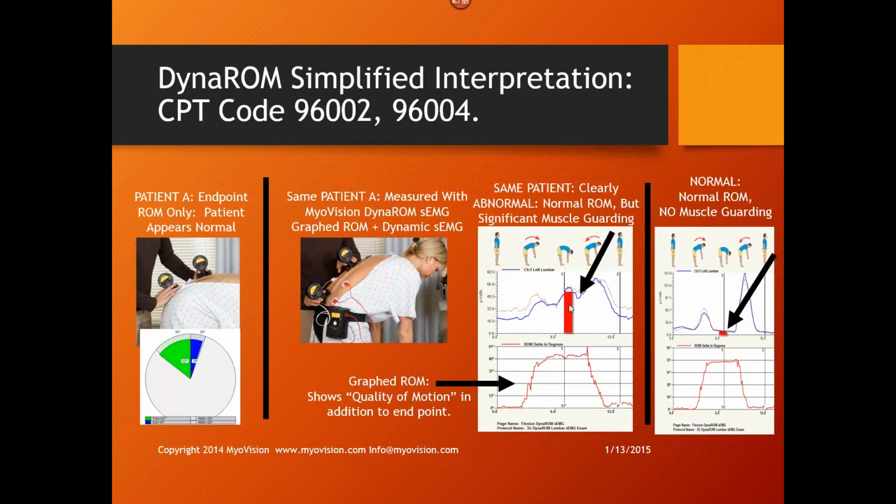Now, just to point this out, for those that are doing personal injury work too, we have a whole new thing I want you to know about where we actually show in these graphics. Attorneys are going crazy over this. You can bill it. We're getting a significant increase in reimbursement over the last 4 or 5 years now. It's been very good. It's approximately $250 a test, but the main thing is that we're changing this entire paradigm when it comes to personal injury. In the past, we relied upon range of motion, and this is just one example of a real case that went to court.